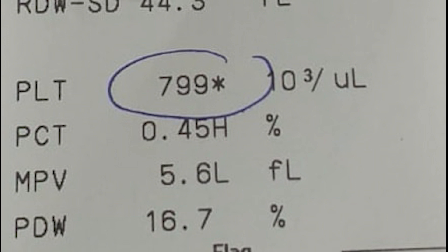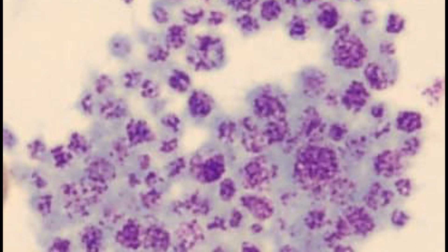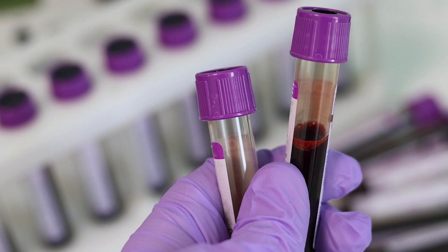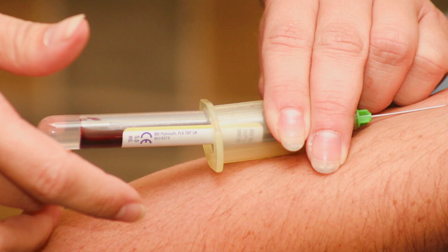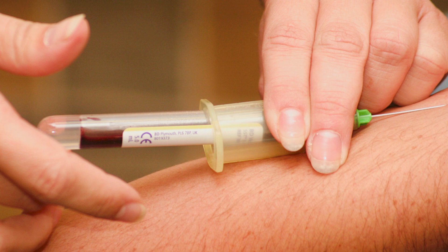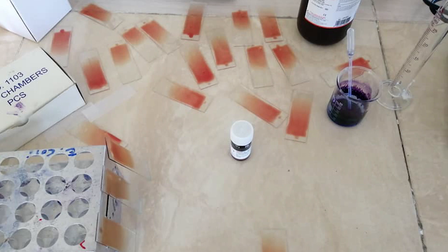Rare serious conditions such as thrombotic thrombocytopenic purpura, hemolytic uremic syndrome, and disseminated intravascular coagulation, and surgery where platelets can be destroyed when passing through machines used in bypass surgery, blood transfusion, or artificial heart valves. Whenever we get a low platelet count and the delta check has failed — meaning the same patient's previous sample platelet count was normal — we need to check the sample for any clot or fibrin clot. The platelet count may be repeated after properly mixing the sample.